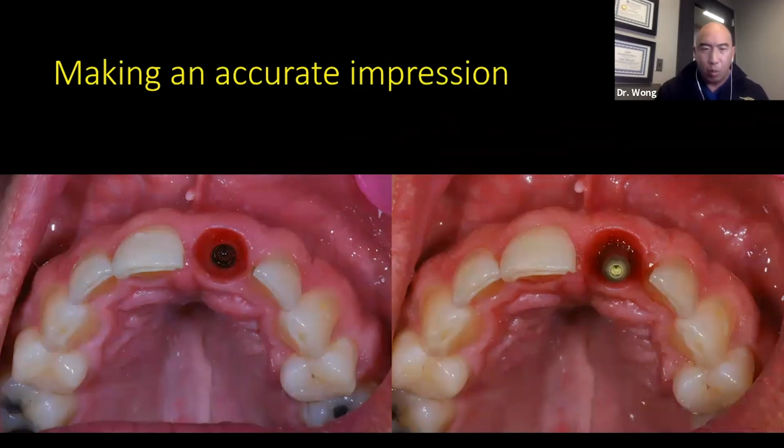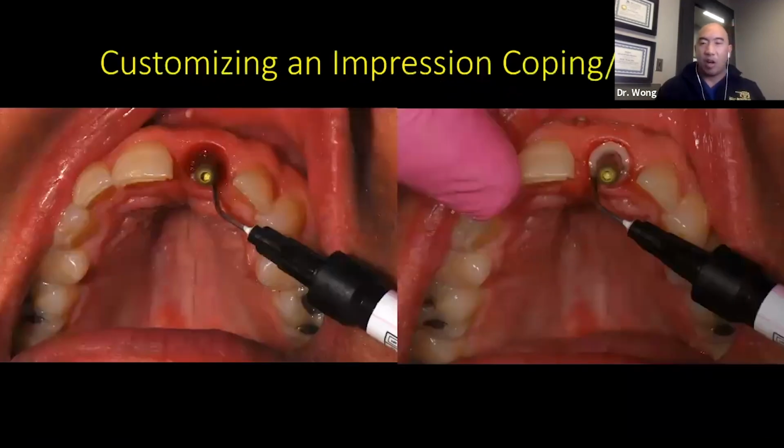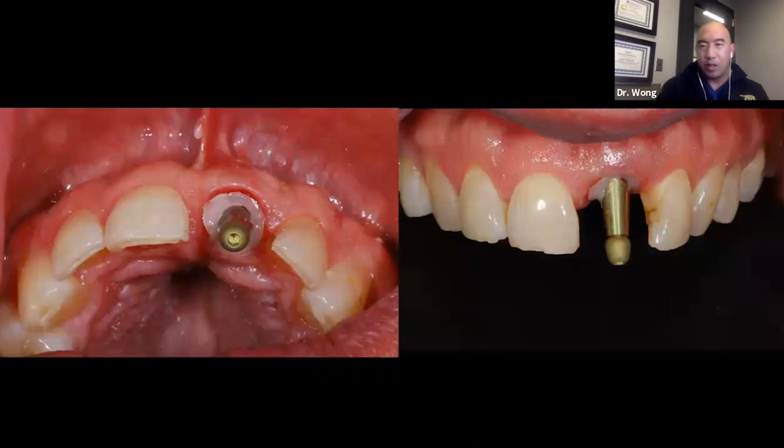At this point, what you're going to want to do is put your impression coping on and take an impression. But here's the kicker. You can see on the right, as soon as you put that impression coping on, you count to 20, and you can see the tissue's already starting to shrink in around that impression coping. So one trick we're going to start off with, we're not going to end with this trick, but what we're going to start off with is we're just going to get some composite, and we're going to squirt it into the sulcus and around the impression coping, and then we're going to cure it. What that's going to do is prevent the soft tissues from collapsing in there.